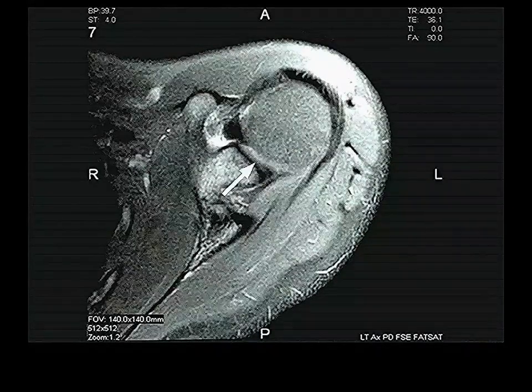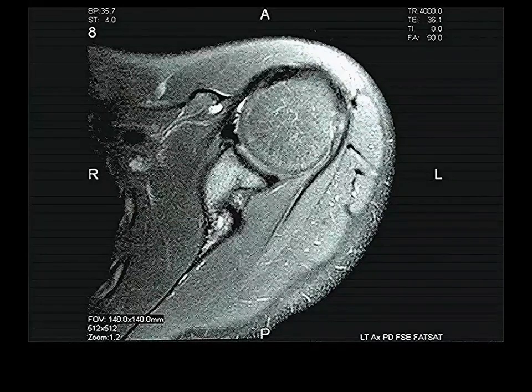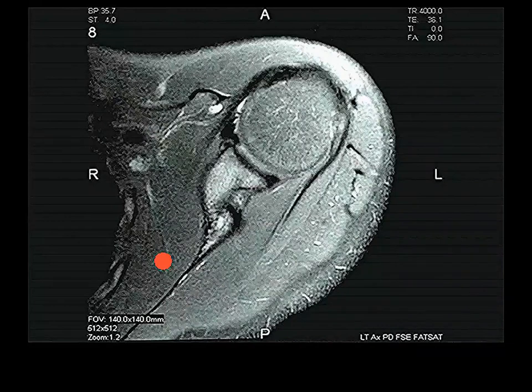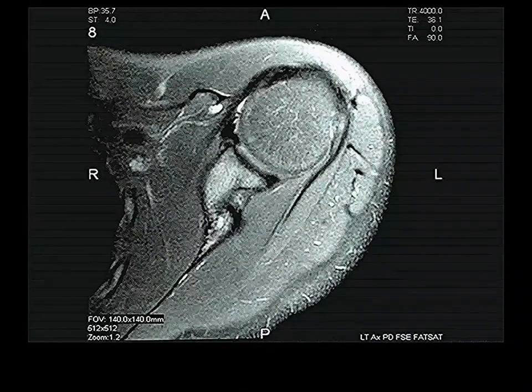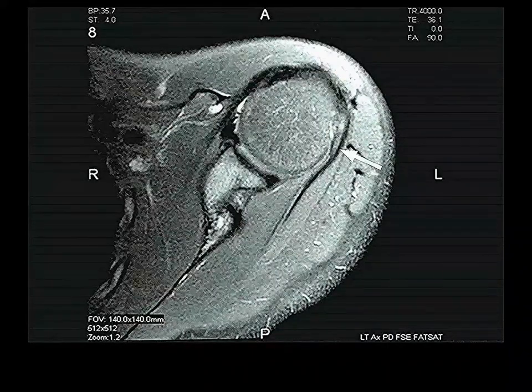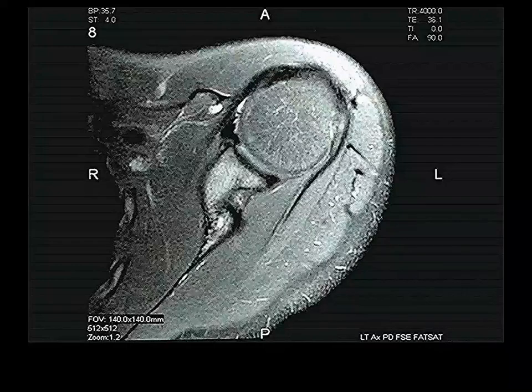Still coracoid. Here's the glenoid right here, head of humerus. Glenoid, now the scapular blade right here, so this must all be subscapularis on the ventral aspect of the scapular blade. This looks probably infraspinatus on the posterior aspect of the scapular blade. Here's the tendon of infraspinatus actually, so it is tendon of infraspinatus.